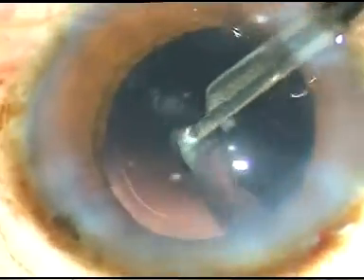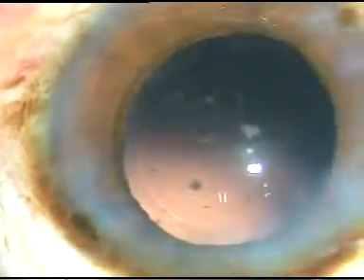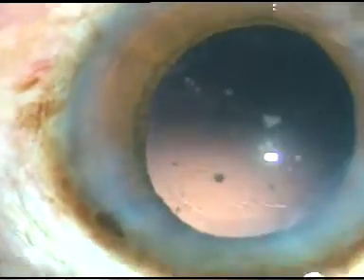The cortical matter is nicely removed. I polish the posterior capsule a little bit. The posterior capsule is very clear in this case.